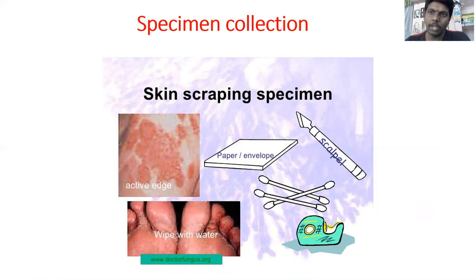If we are going to collect from the skin, then we need to go for scraping. First we will take a scalpel and scrape the surface of the skin, and take a little bit of fungal sample. And we will go for laboratory diagnosis.